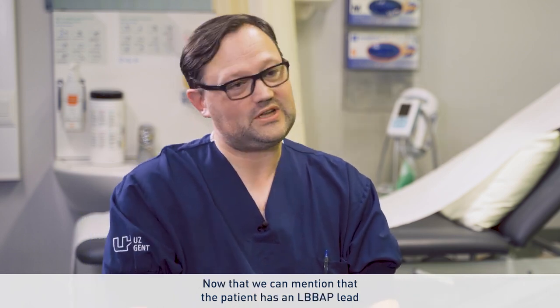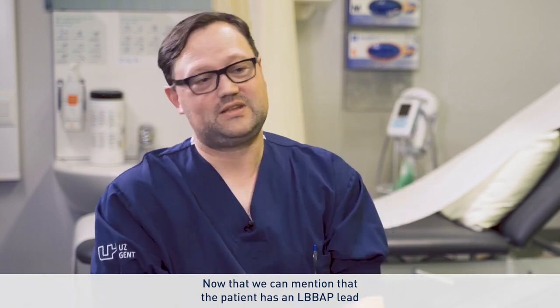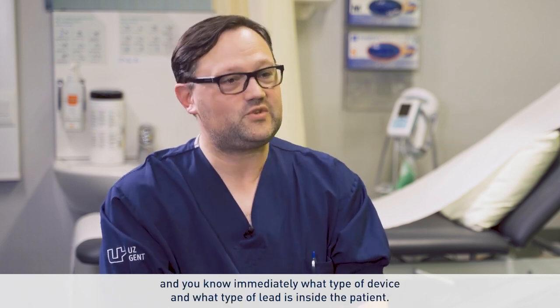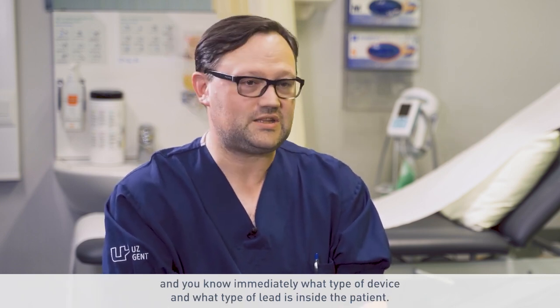So now that we can mention that the patient has an LBBAP lead, the first look you have on the screen, you know immediately what type of device and what type of lead is inside the patient.